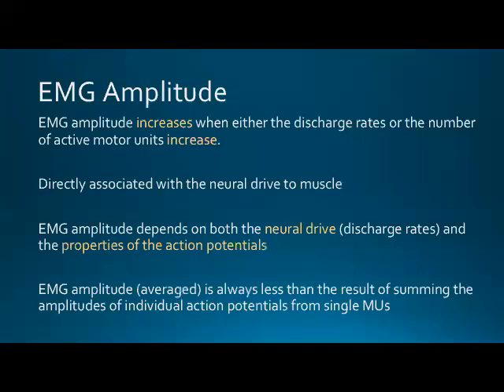It's gonna be lower than if we looked at the exact signal of all the individual motor units. So this kind of answers your question, Zach. If you look at the bipolar surface electrode signal versus the intramuscular, the bipolar is always going to be lower. The summated signal is always going to be lower than the signal that would be produced from each individual motor unit itself. So we're losing some of that activity because we're kind of averaging it or summing it across multiple motor units.